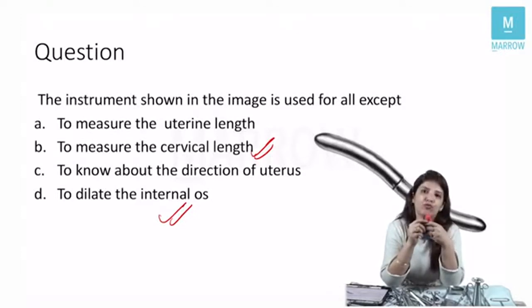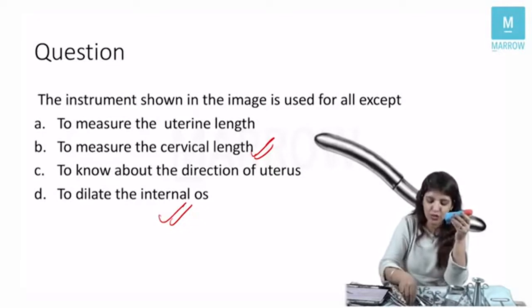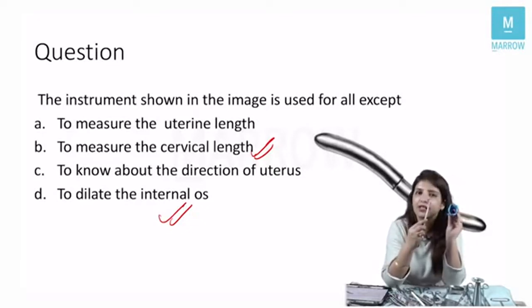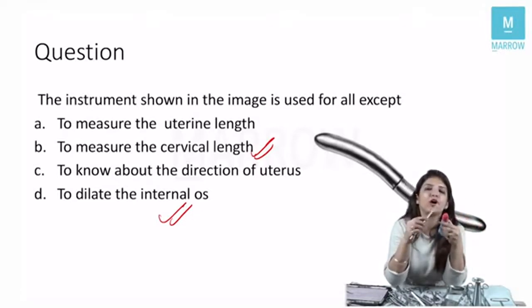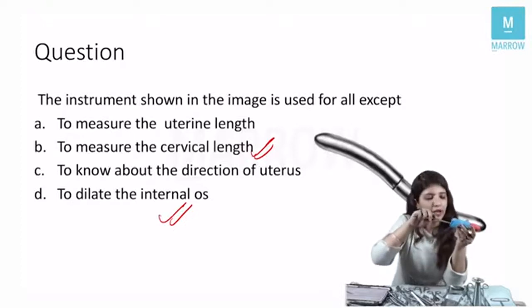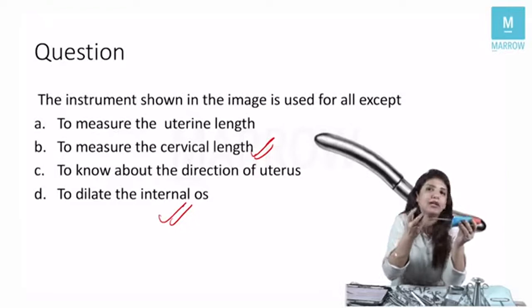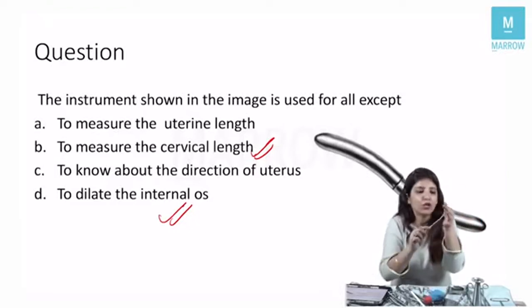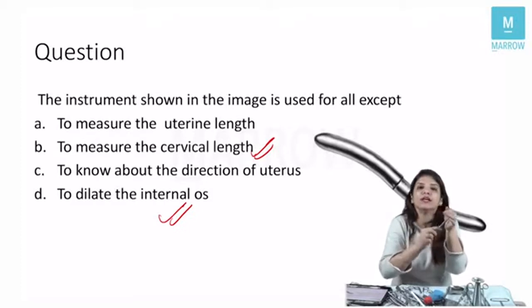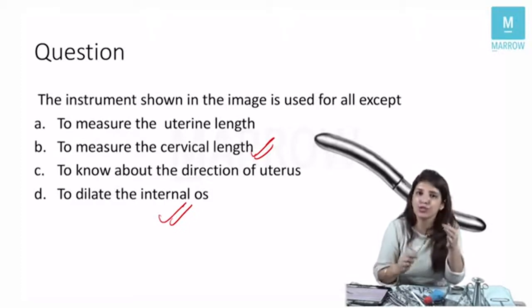In a non-pregnant female, if I have to diagnose cervical incompetence, I can use a number 8 Hagar's dilator. See, normally if the internal os is of normal size, when you put a number 8 Hagar dilator, the female is going to resist, right? Because the internal os would be closed, and if you try to put a number 8 Hagar dilator, she's going to resist.